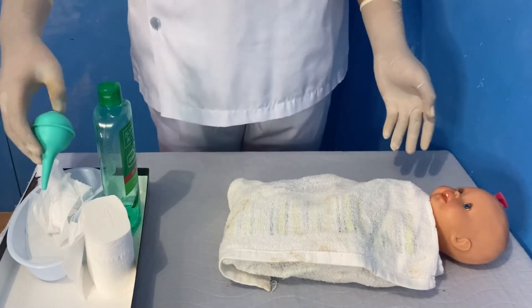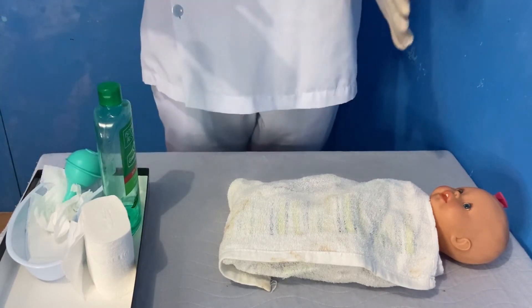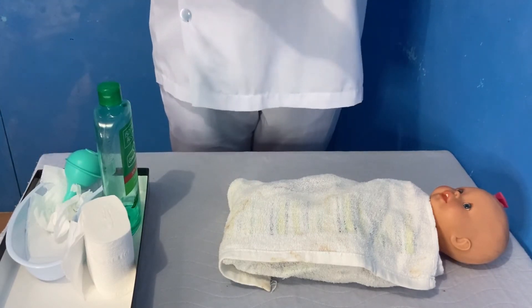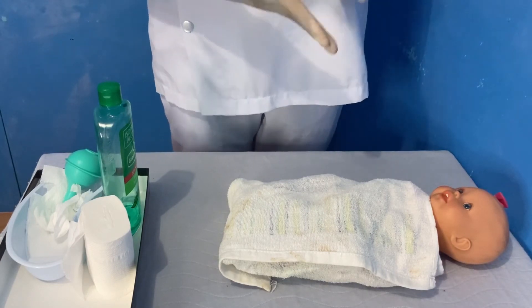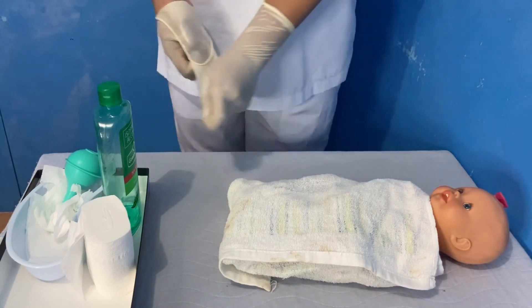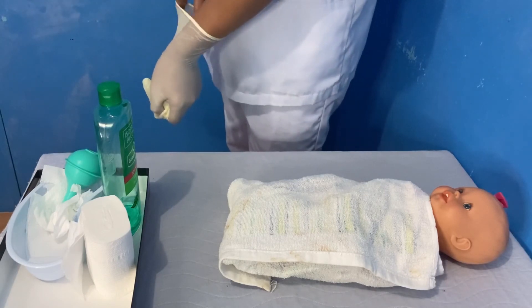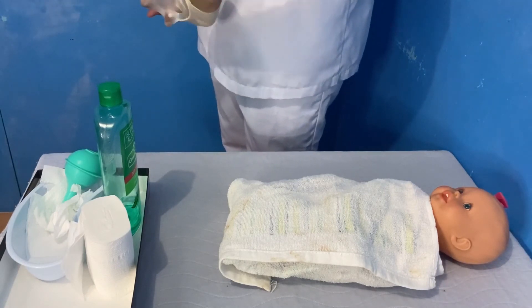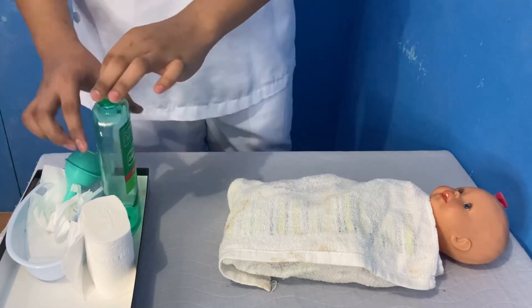Discard the collected secretion properly and clean the receptacle. Wash the bulb syringe in warm soapy water, rinse, and dry. Put the bulb syringe back in the newborn's bassinet for future use. Then remove gloves and perform hand hygiene.